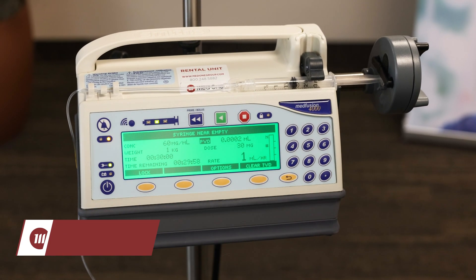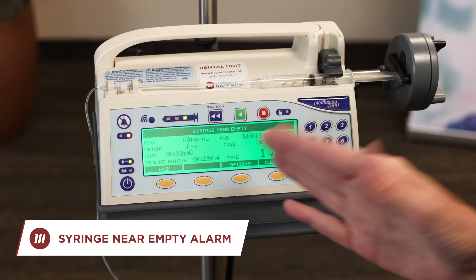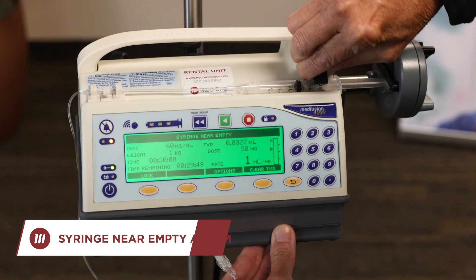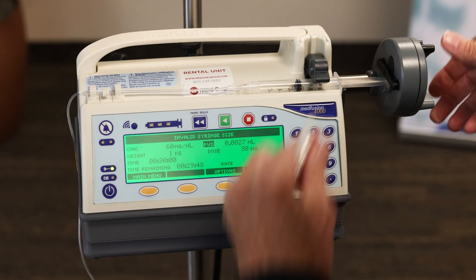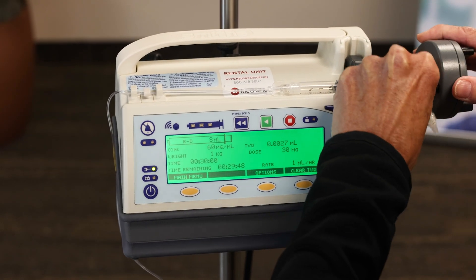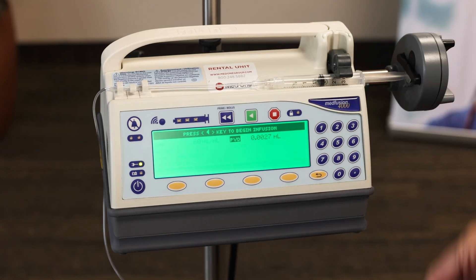Here's an example of an alarm that says the syringe is near empty. This could happen — you may just want to make sure that you have your syringe loaded properly and in place, so just double check that. Then I will try to press the green button to start it again.